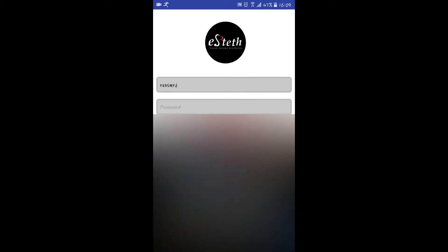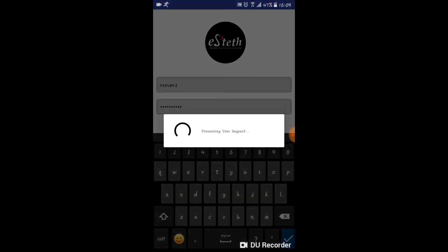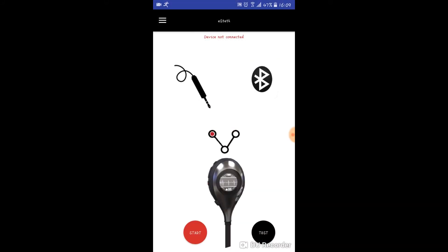You can simply use the plug-in function of the e-steth or you can also use the Bluetooth connection. Please make sure you have plugged in the wires of the e-steth both ways.